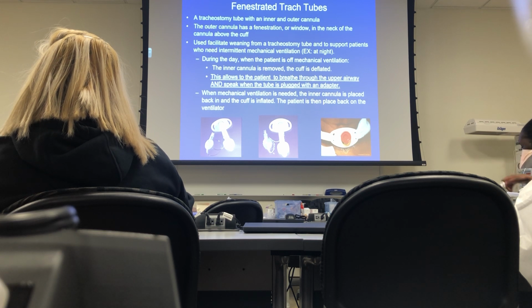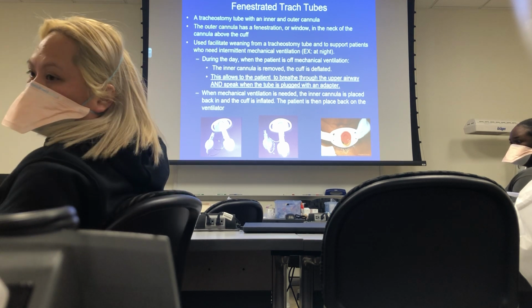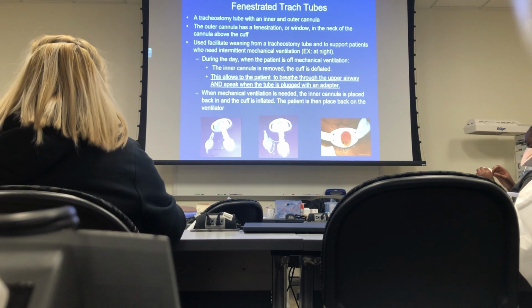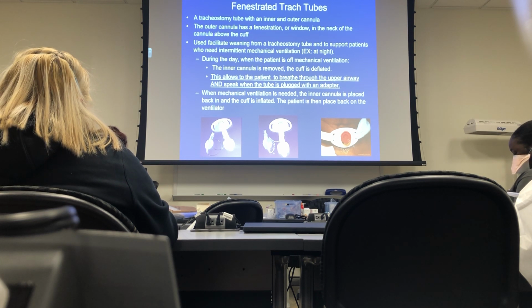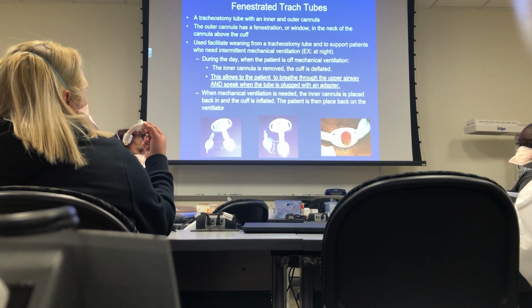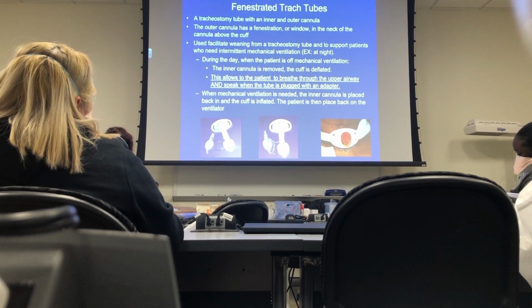Okay? So the outer cannula has a fenestration. Everybody point to the fenestration. Outer cannula has a fenestration. That's why it's called a fenestrated trach. Okay, everybody's got that? All right, the outer cannula has a hole or a window. Okay, some people don't have little holes, some people have windows. Who has a window? Okay, Demi has a window. Demi Lowell has a window, okay? All right, it's used to facilitate weaning from a trach tube or from the ventilator. How do we do this?